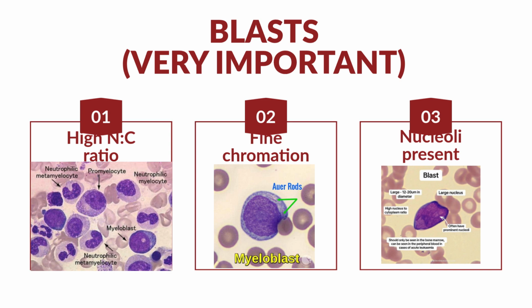The fourth stage would be the metamyelocyte. You see that little bend? It ain't quite a banana. It looks like a little kidney bean here. And we got a couple of those there. Then you got that little bow tie one that looks almost ready, but we came out too fast. And we literally identified all of these white blood cells in this one picture, because we just reviewed everything. Don't you feel accomplished today? I know I do.